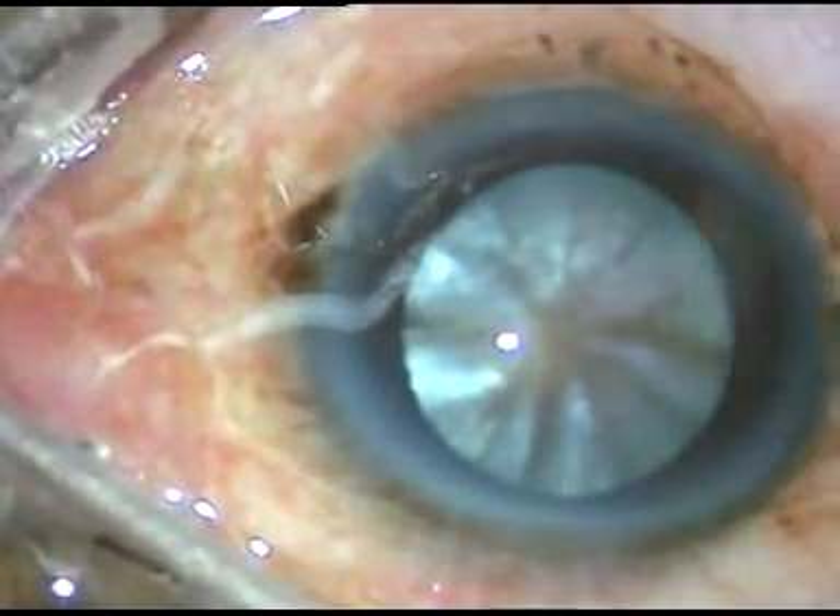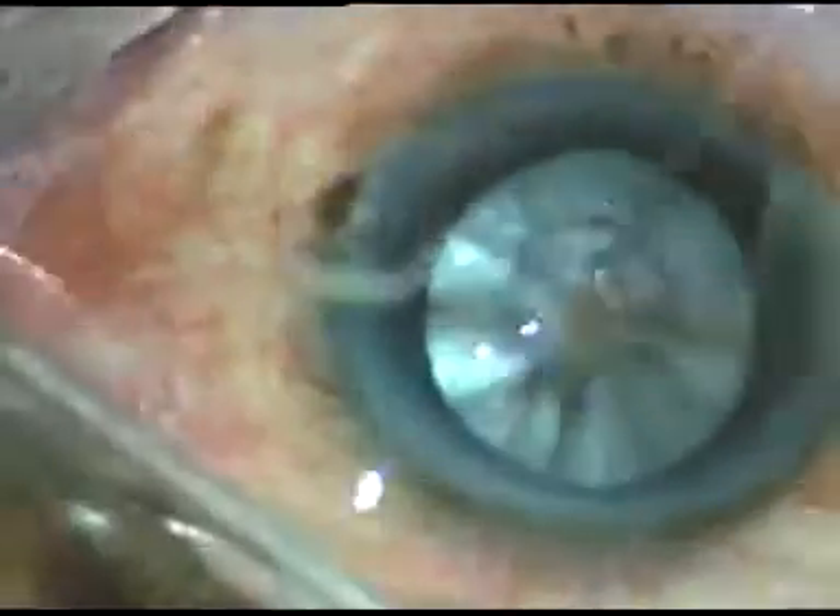Dear colleagues, this is a hard intubescent cataract. We can see the radial water clefts in this case.